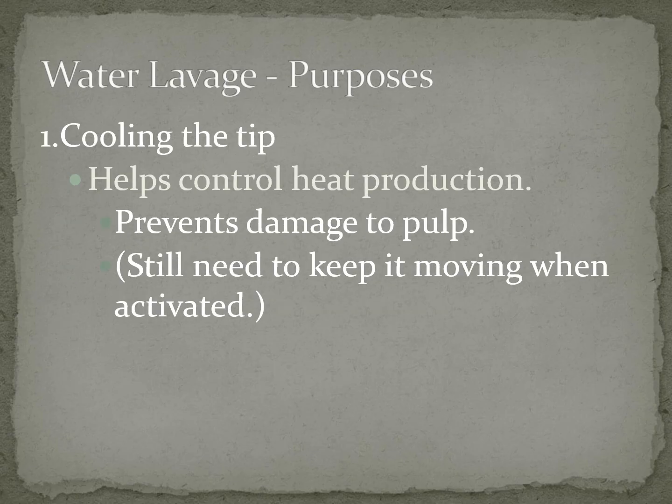So as far as cooling the tip, it's going to help control that heat production. It's going to prevent damage to our pulp. We do, though, never stop moving the entire time we have the tip activated. We want to constantly move, move, move. You'll hear me say sweep, sweep, sweep. So we constantly want to keep that tip moving. If you leave it in one spot too long, it can heat that tooth up and we can cause damage to the pulp.